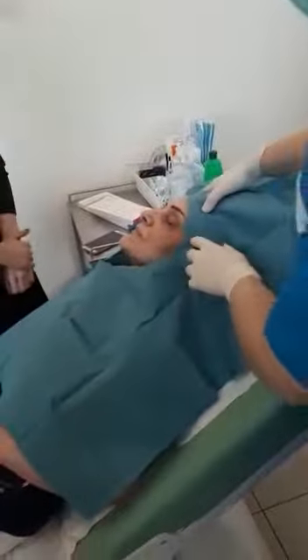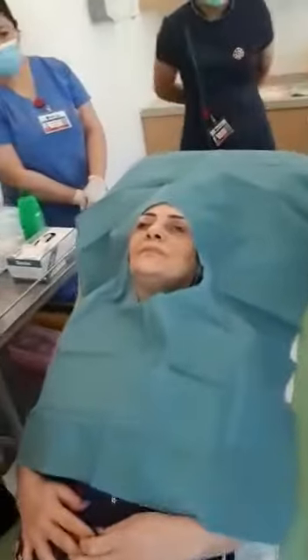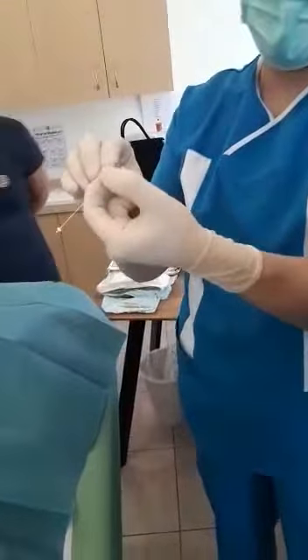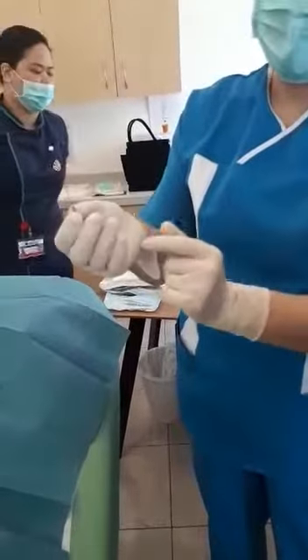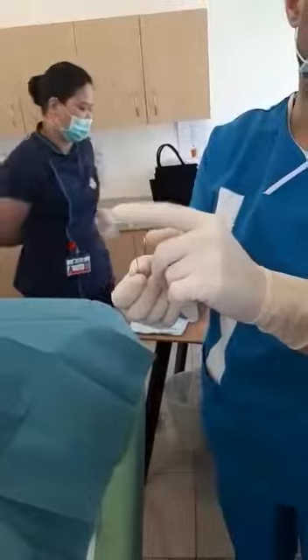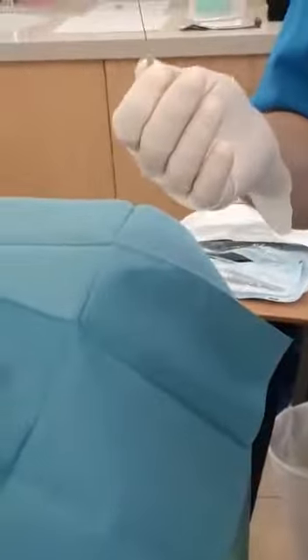Okay. From this side. I will work from this side. Cannula. The thread is inside, 7 centimeter long. You see here, and you cannot see over there. It's inside. This is not blunt. This is a sharp cannula. That means that it could enter the skin, but we're going to make it more comfortable for her with a needle, and then we put it inside. No exit point. The thread will be fixed in the tissue by itself.